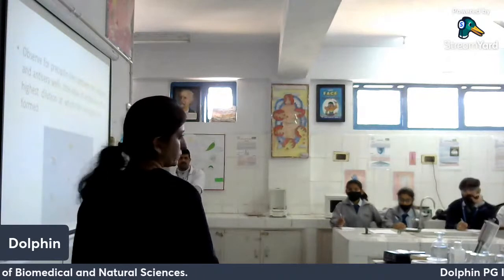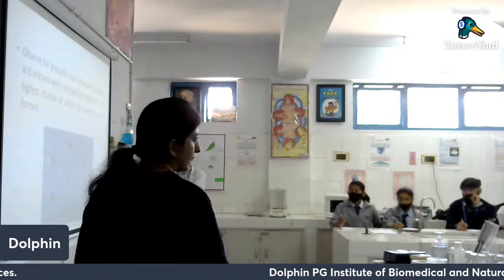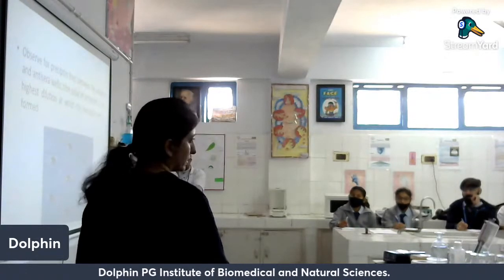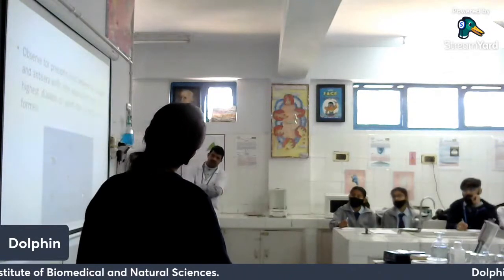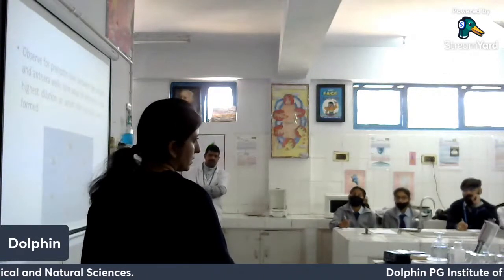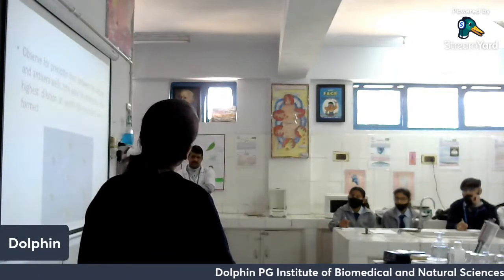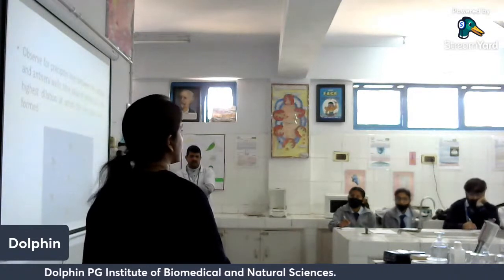So at these dilutions we are getting the precipitin line, and we are not getting any line here. Right? We are not getting any line here. Starting from the undiluted sample, it goes through these dilutions. Okay, we are counting from this. So the highest dilution where you can observe a line, that is the titer value of your sample.